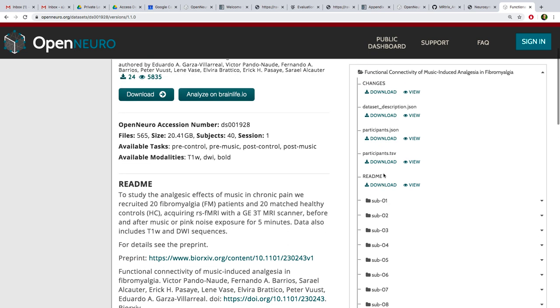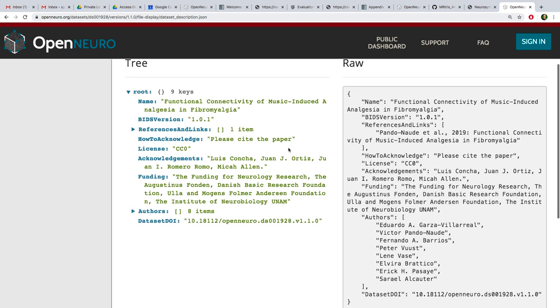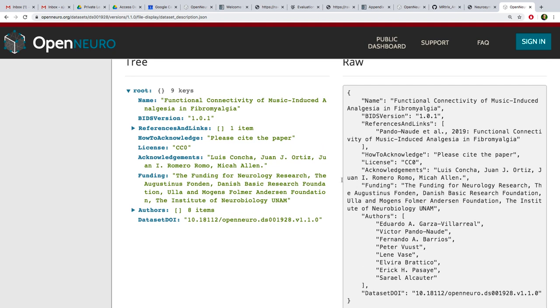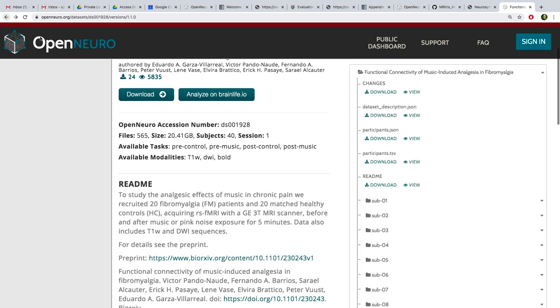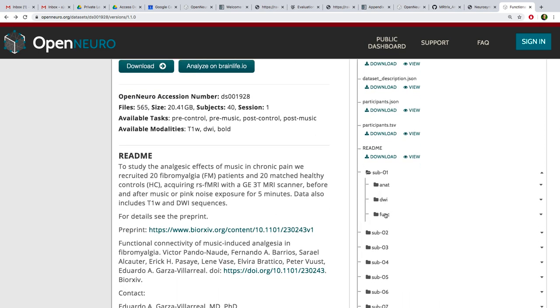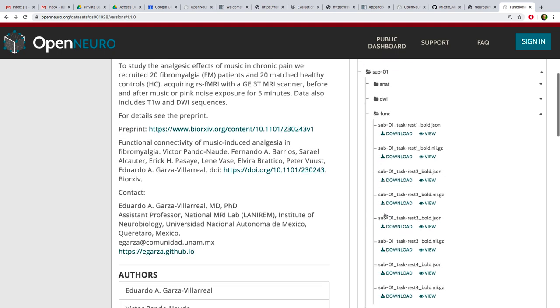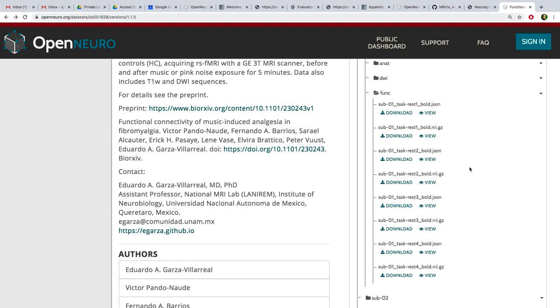The first thing I'd look at for this data set — we'll need some basic parameters. I'm looking for the TR in the JSON file. Repetition time is three seconds. And it looks like the acquisition was interleaved, if I'm reading this correctly — a pretty standard Siemens interleaved sequence. Those are the two main things I need to know.